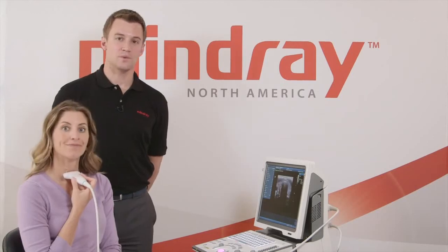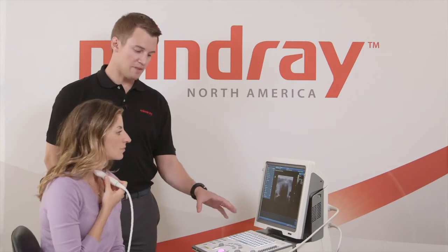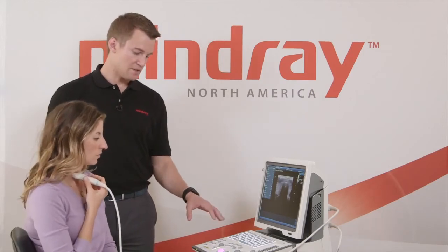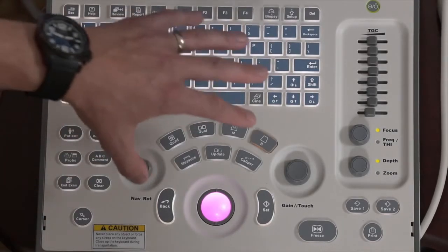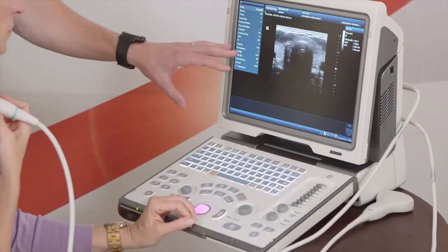Now that we're scanning and we've made a few little adjustments such as our gain and our focus, depth and things like that, we can start talking about the different modes. And we're usually scanning just B mode, which is basic 2D ultrasound. We can see that on the screen.